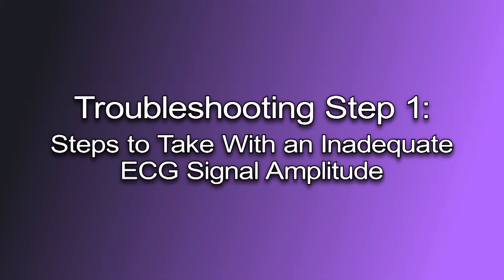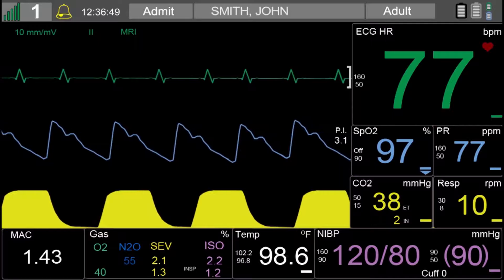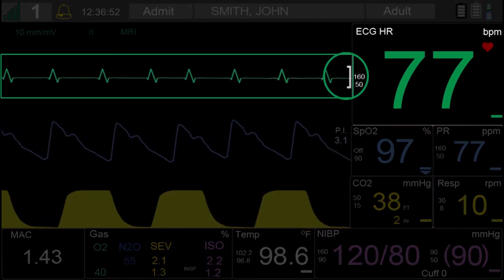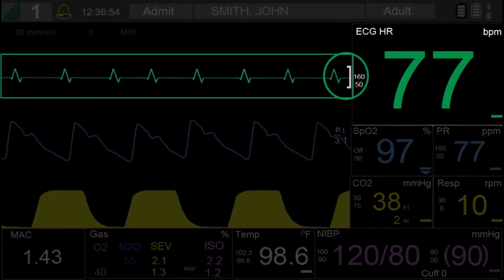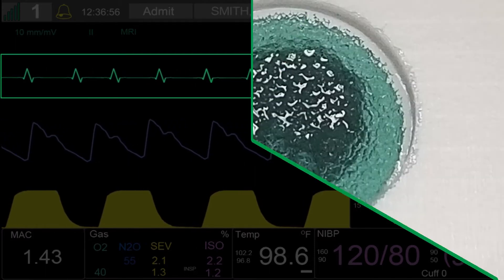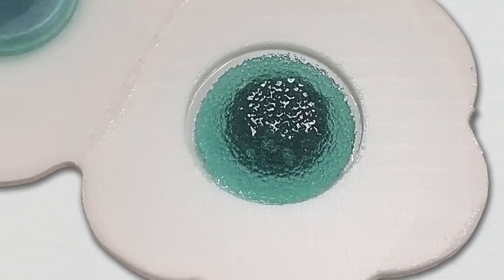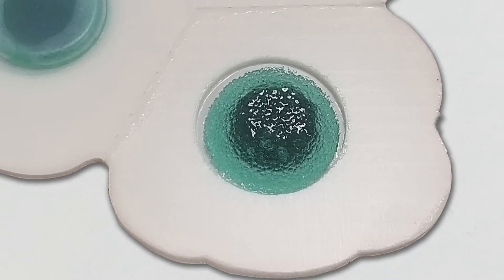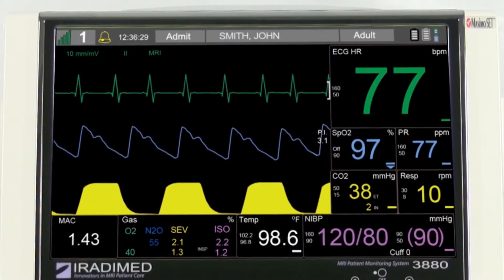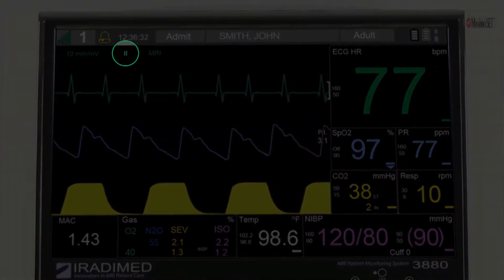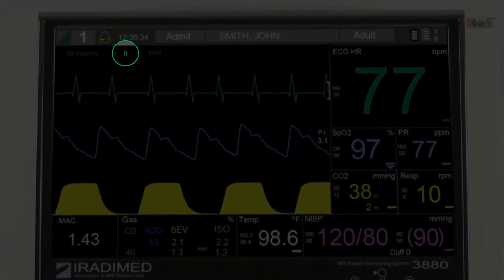Troubleshooting Step 1: Steps to take with inadequate ECG signal amplitude. If the ECG QRS amplitude is less than the signal quality indicator height, the user will check to make sure the electrodes being used are within the expiration date and the contact sponge is completely saturated with gel. Select a different lead view on the 3880, as leads 1, 2, and 5 tend to have the highest QRS amplitudes.